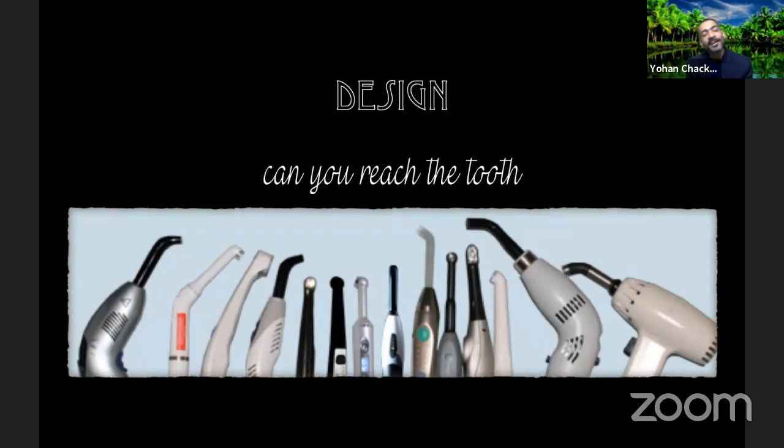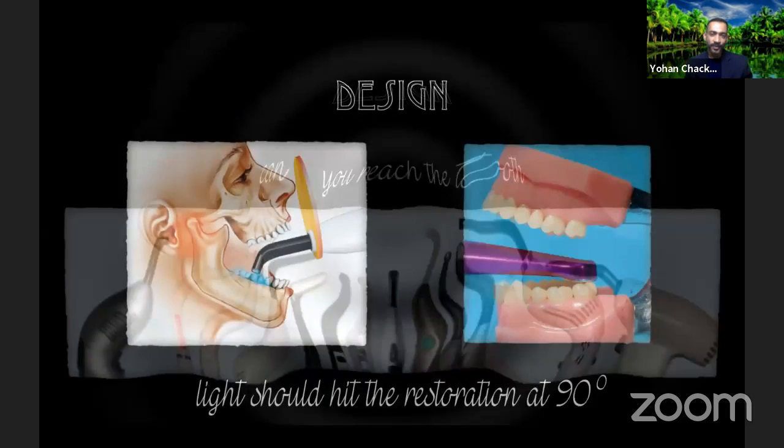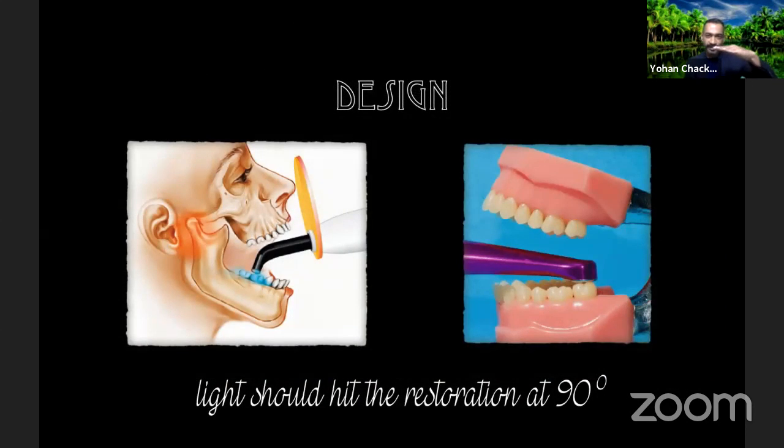Then we come to the design of the light. There are many, many designs available on the market today. Earlier, they all came with a little curved tip so that you could reach into the mouth. We realized after some time that perhaps this curved tip design was not really the best thing to do, because when it comes to curing, the head of your curing light, or where the light outputs from, has to be at 90 degrees to the restoration.